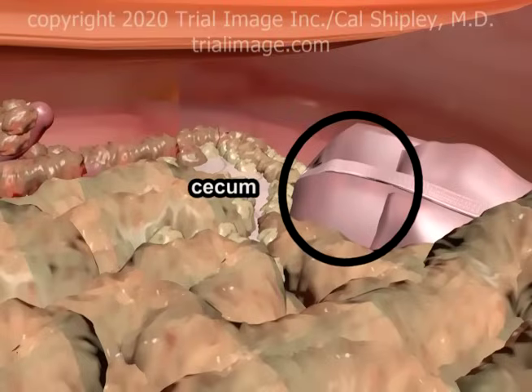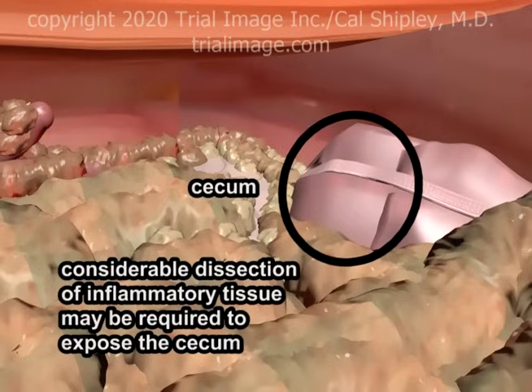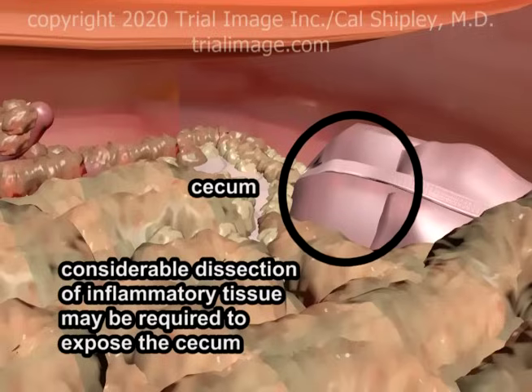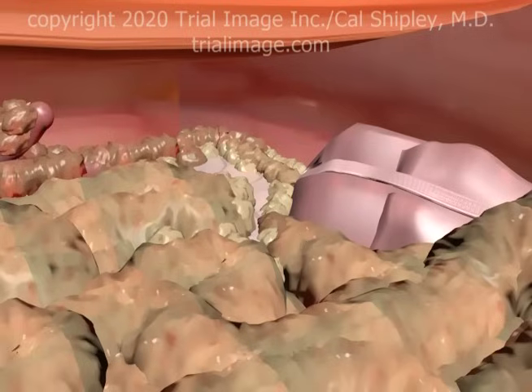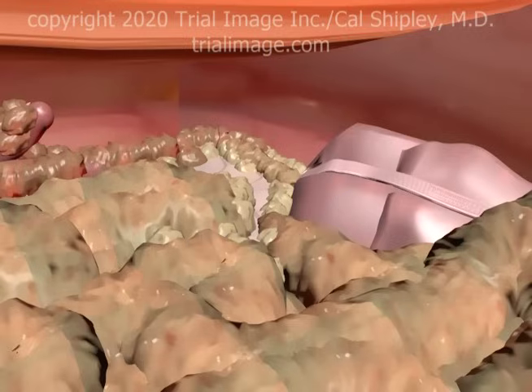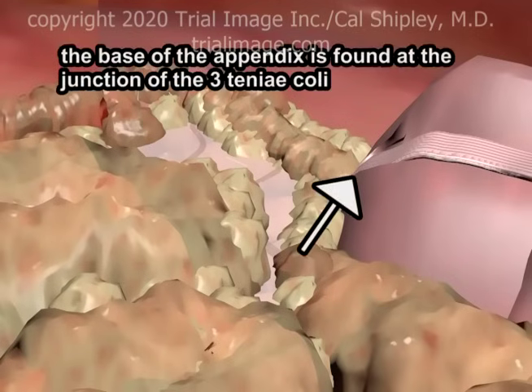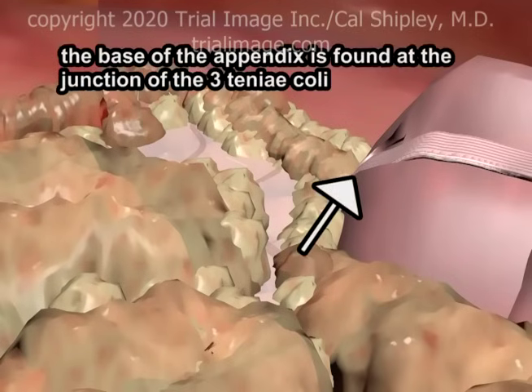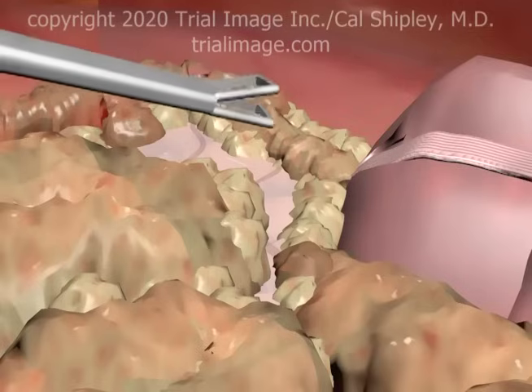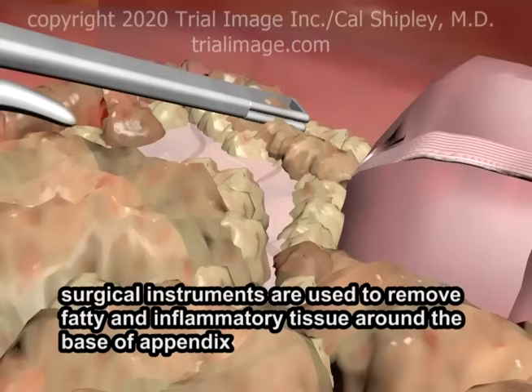Upon entering the abdominal cavity, the surgeon locates the cecum. Depending on the degree of inflammatory reaction around the infected appendix, a fair amount of tissue dissection may be required to expose the cecum. Once the cecum has been identified, the teniae coli may be used to determine the location of the base of the appendix. Surgical instruments are used to remove fatty and inflammatory tissue around the base of the appendix.